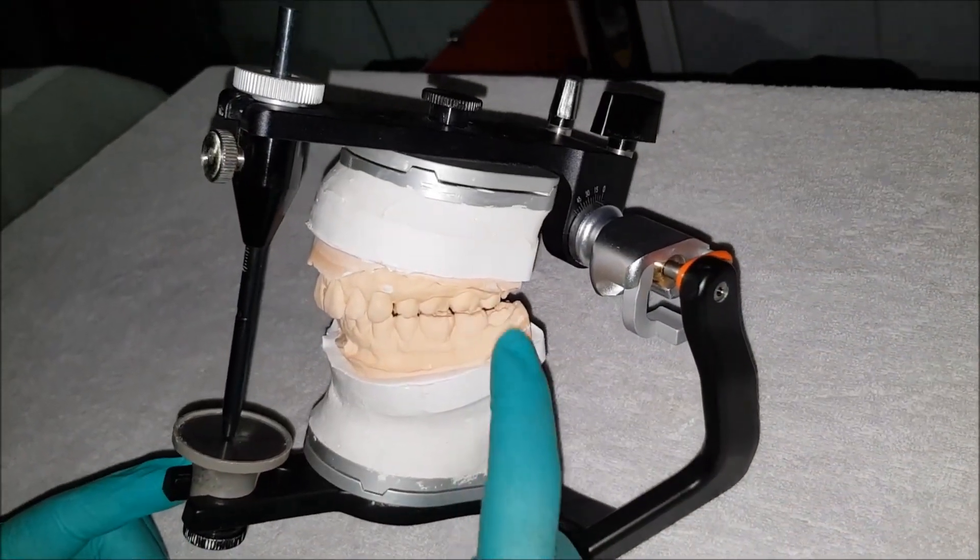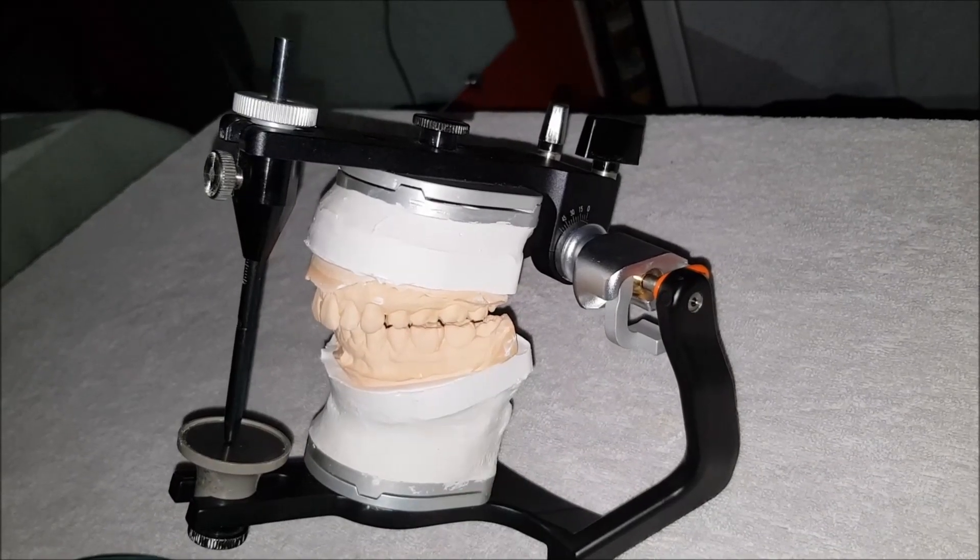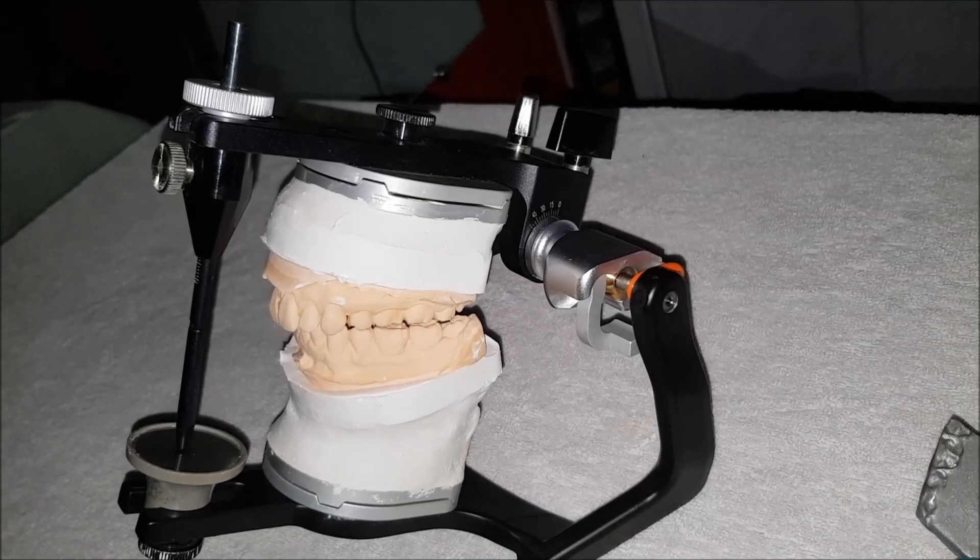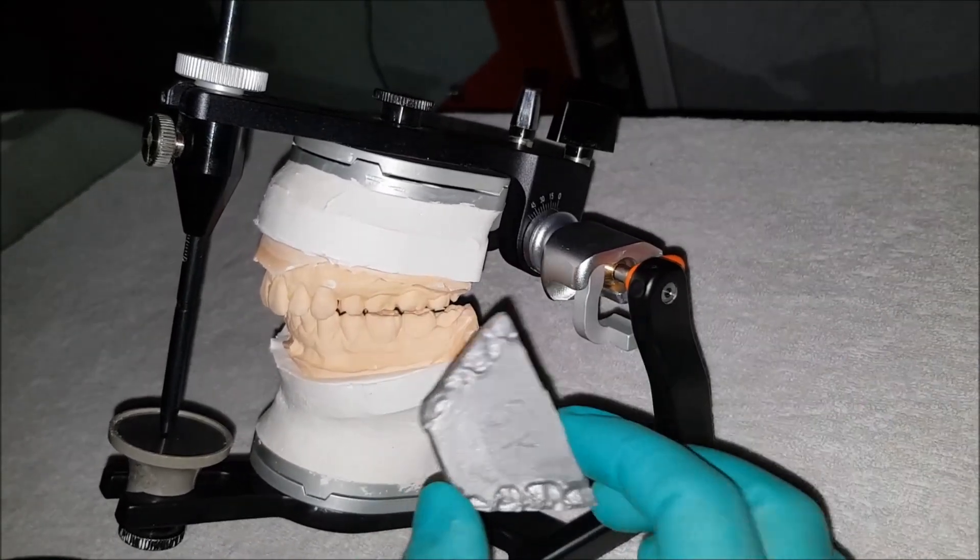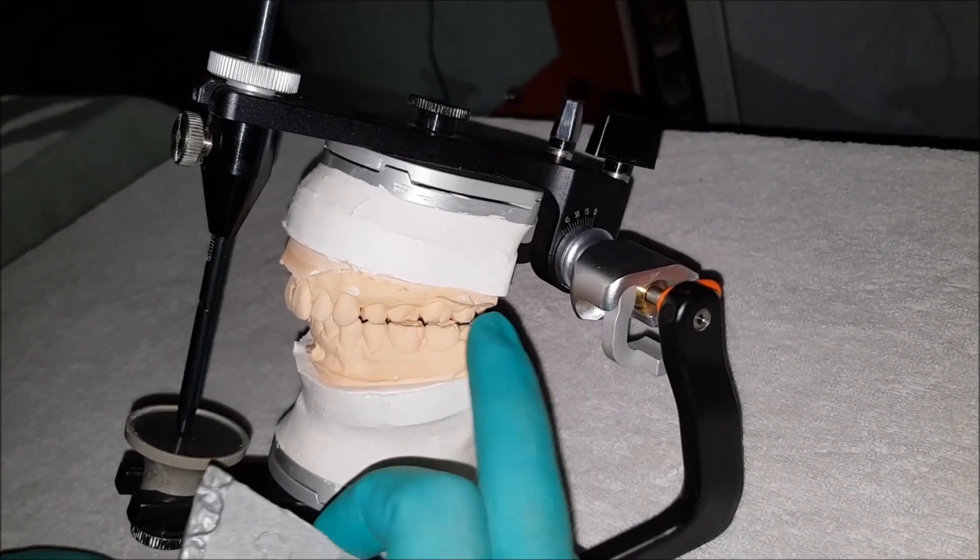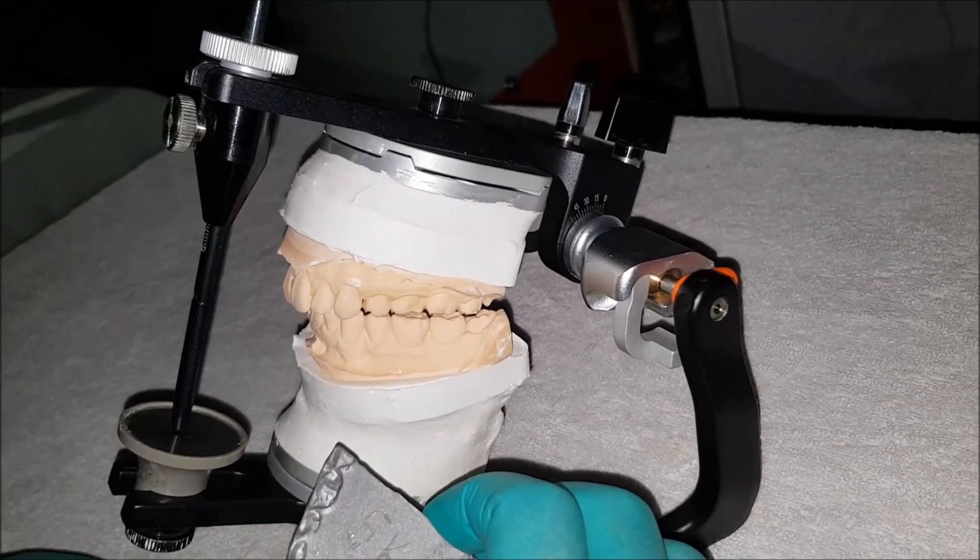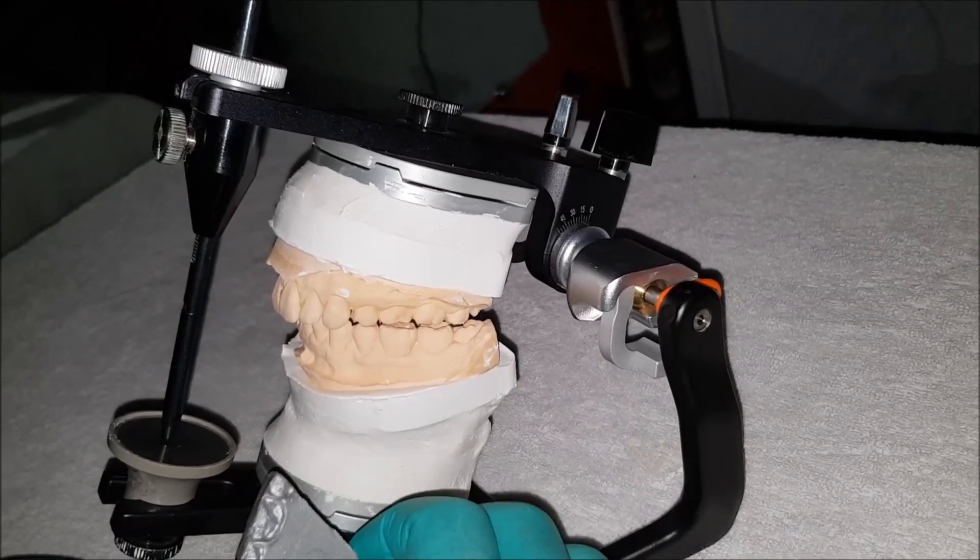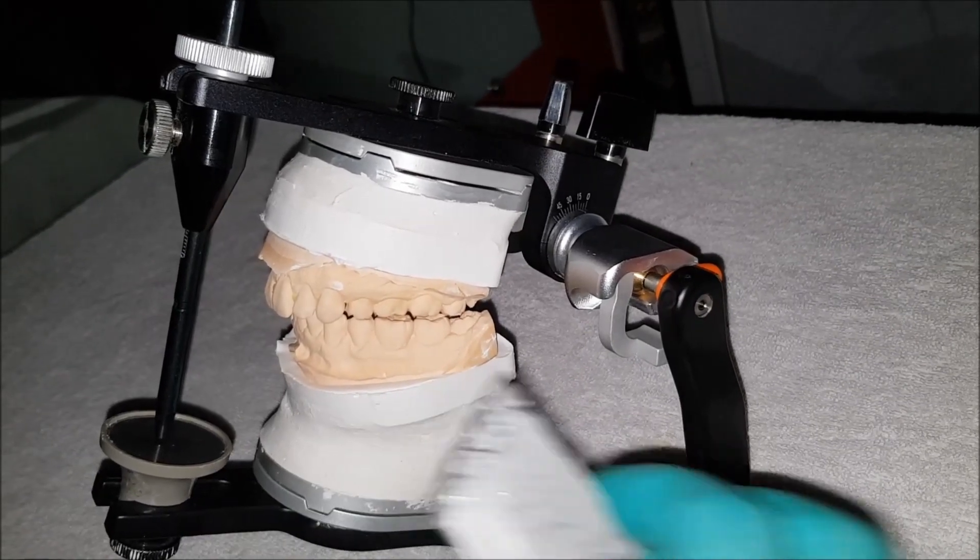Here we have the patient's maxillary and mandibular casts that are mounted in centric relation. In this video, I will show you how to program the articulator, which means customizing the condylar guidance with the help of the protrusive record. In this particular articulator, the lateral condylar guidance is prefixed at 15 degrees, and thus we will use the protrusive record only to gauge what is the correct horizontal condylar guidance angle of the patient.